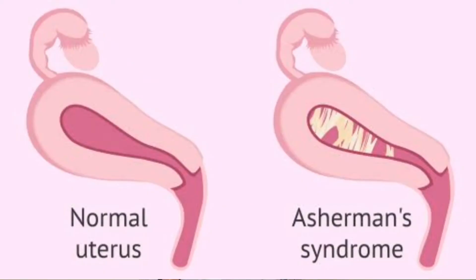Then going to the endometrial cavity, you can evaluate very nicely and thoroughly any type of mass, for example a polyp, or any type of adhesion, for example synechiae. All things can be very nicely seen and examined and even surgically managed in the same sitting. You can have a very good view of both the ostia. So this is what you can see, make out, and manage with the help of hysteroscopy.